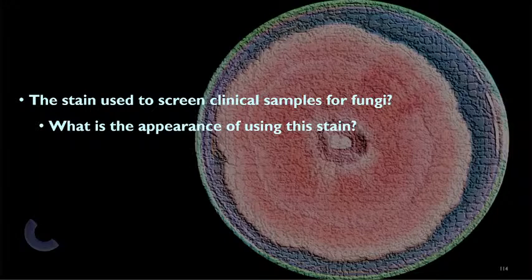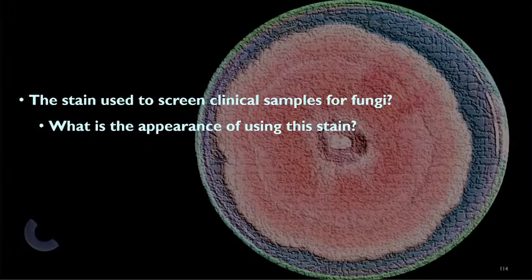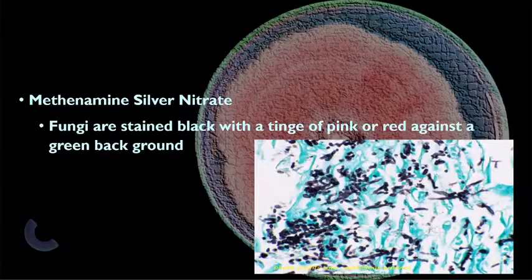It's not anything pathologic. It may be a microbiology. It could be a mycological organism, or it could be a mycological consideration, or it could be a bacteriologic consideration. So methenamine silver is one of those things that we can use. A fungus will stain black.